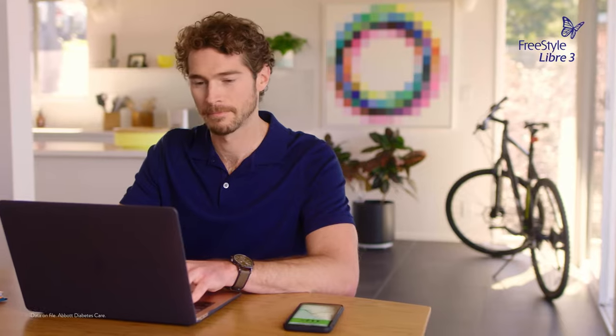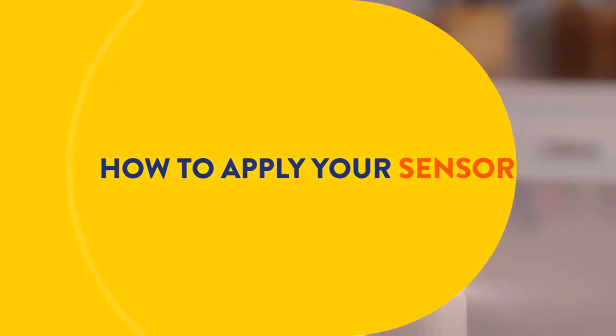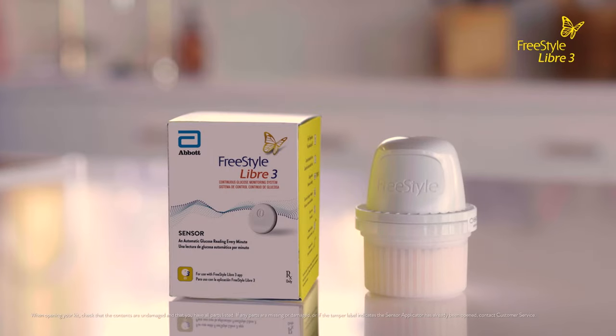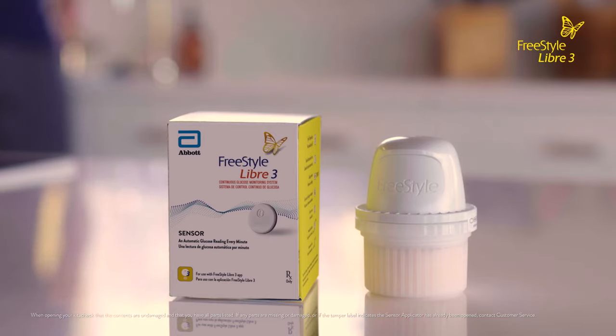The Freestyle Libre system is designed to fit into my life, and applying a sensor is easy. Your Freestyle Libre 3 sensor kit includes a product insert and a sensor applicator, which you will use to apply the sensor to the back of your upper arm.